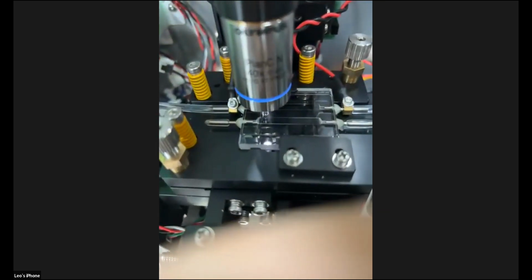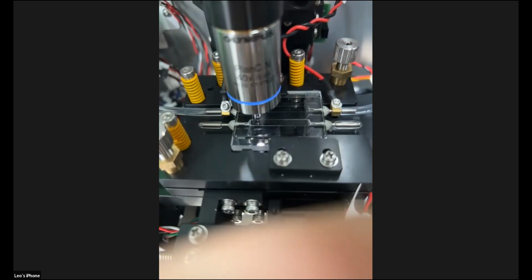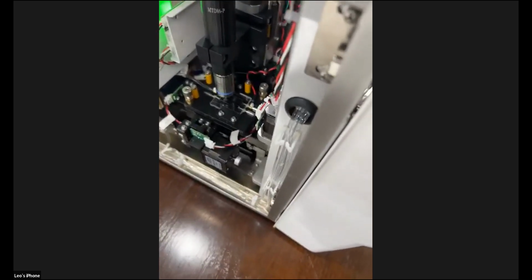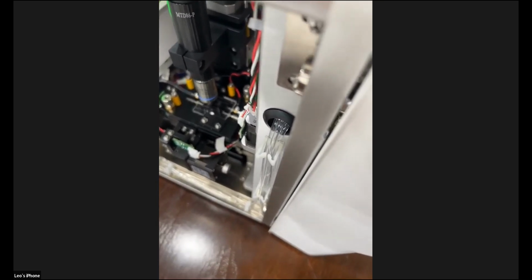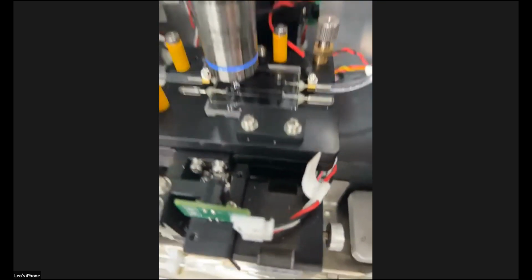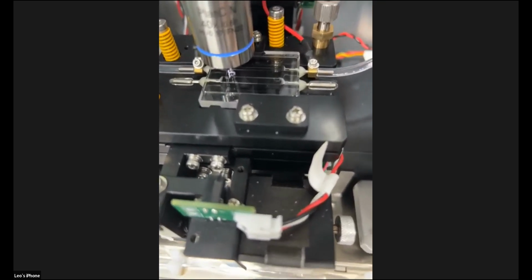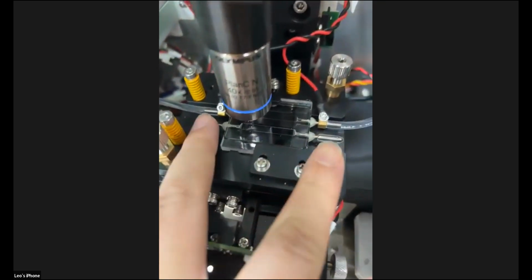Leo, is this the flow chamber the same as the 1000? Actually, the flow chamber is not the same as the 1000 plus. It's a new one. Okay. I think Mr. Chai just introduced that for this one, we have two channels, but we only use one during the test. The other one is for backup. So okay, that's good.